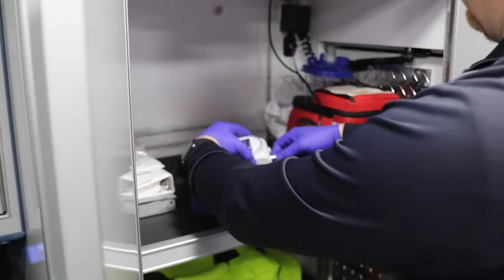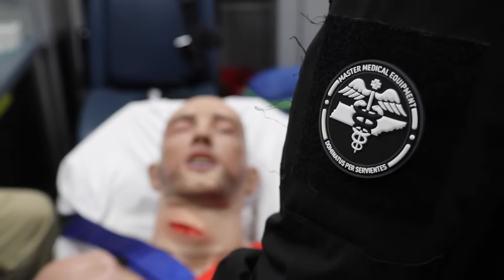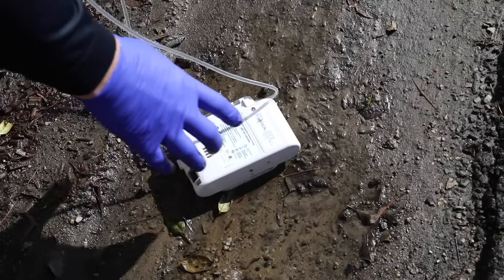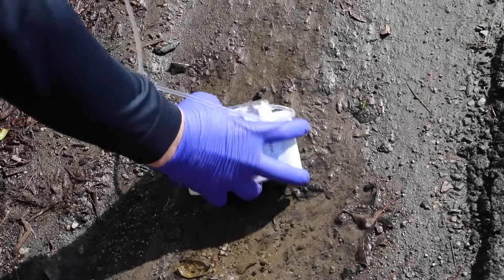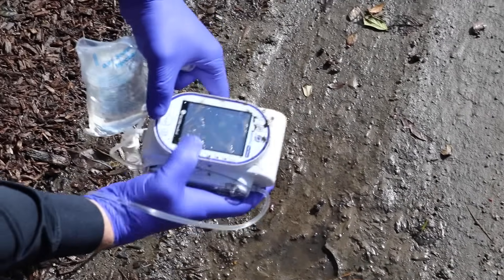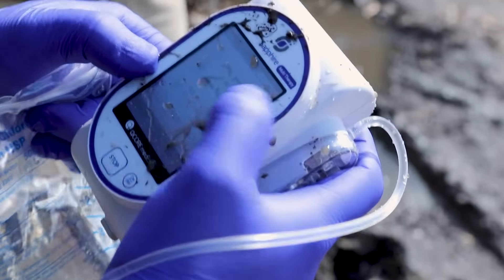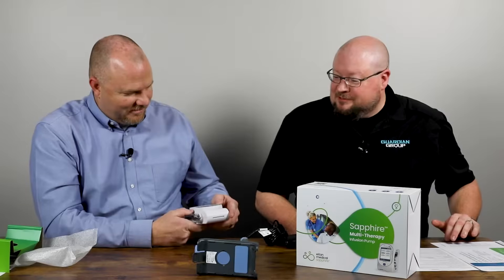Today we're going to talk to you about the Sapphire Infusion Pump. The pump itself has a touchscreen. The screen is pressure sensitive — it's not a heat sensitive screen, so it's not like our cell phones where it's feeling the heat from our fingers. It's actually a pressure screen. And how awesome is that in the EMS field when you're operating these things in the rain, with gloves on.